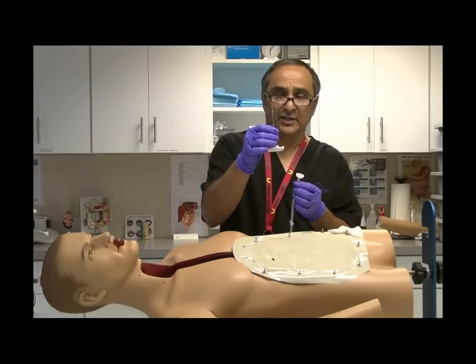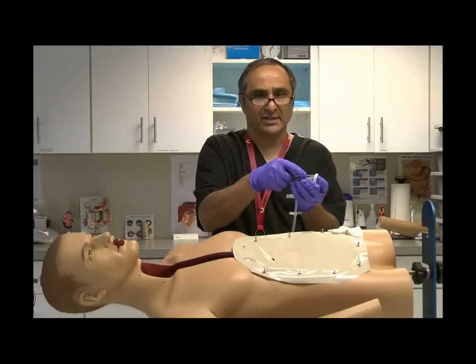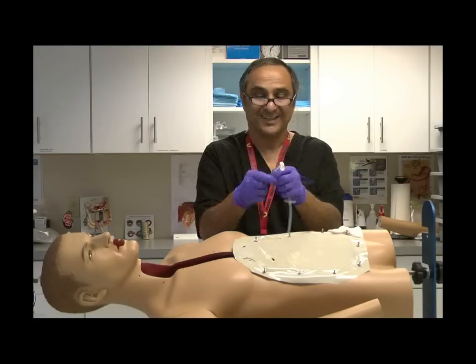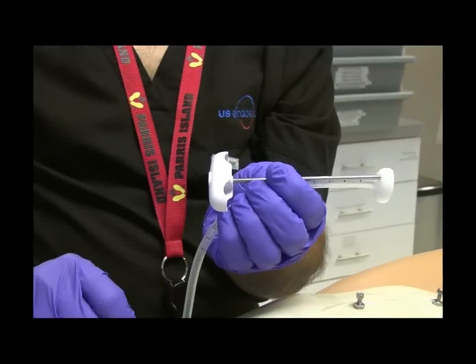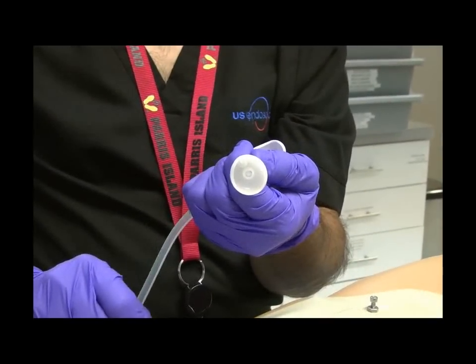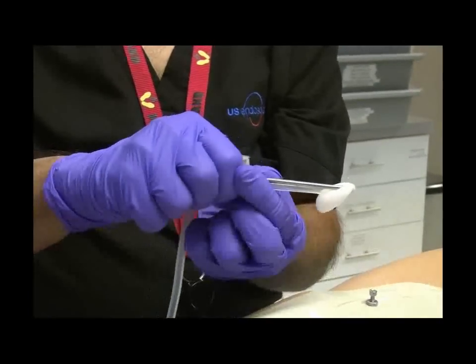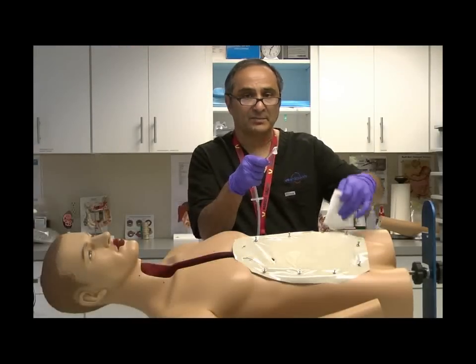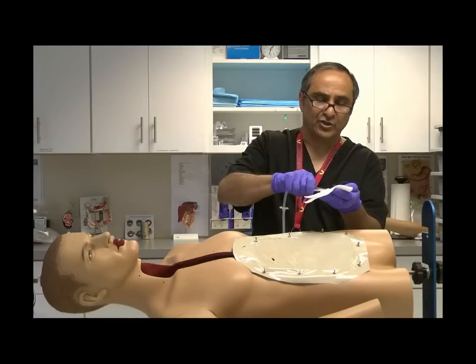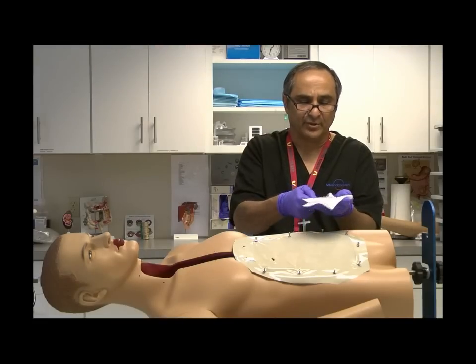At this point, the clinician should take the obturator, take the metal blunt-tipped end, and insert it into the dimple hole that was molded into the dome. Simply stretch and then grab and hold tightly. As you can see, the mushroom went from a circle or a round structure to an elongated oval structure. That's the whole principle behind placement. At this point, the clinician should generously lubricate the dome, the tube, and the obturator.